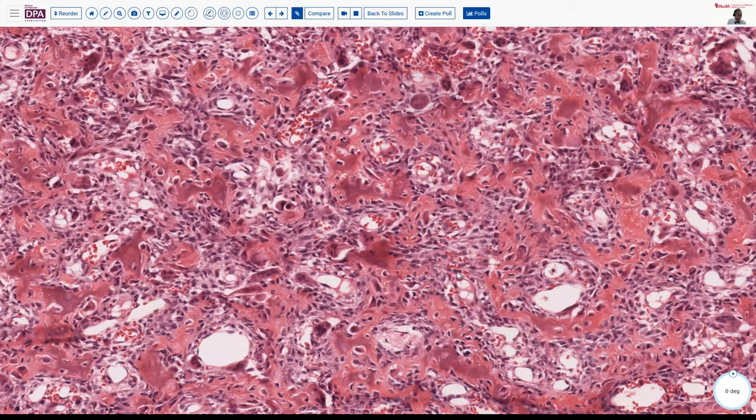because I would say, oh, it's a bone-forming lesion. And this underscores the vital importance of knowing what the radiographic appearance is and knowing the clinical history, because if I associate this lesion with what I just showed you radiographically, I would never dream of making the diagnosis of osteosarcoma, but would instead, as Dr. Datt has said, make the diagnosis of osteoid osteoma.